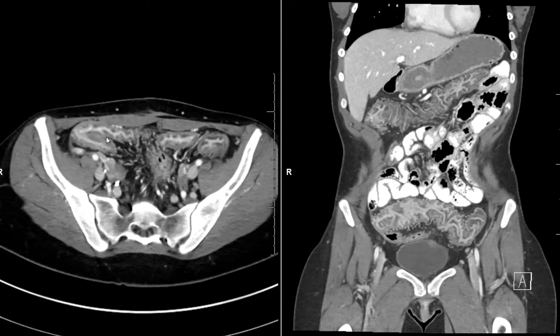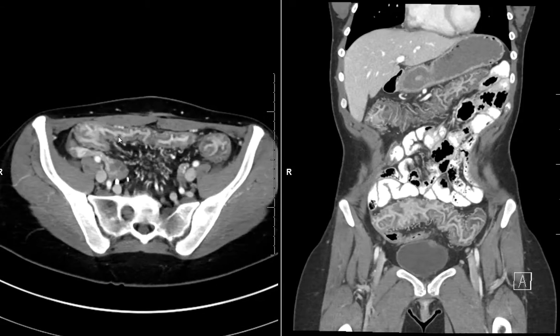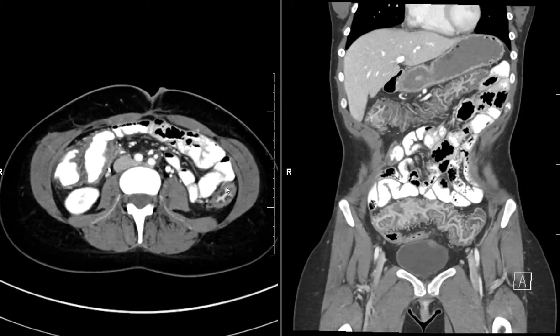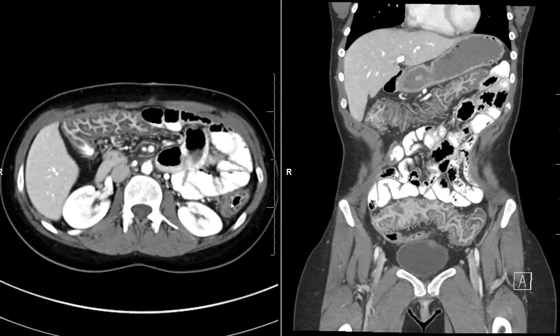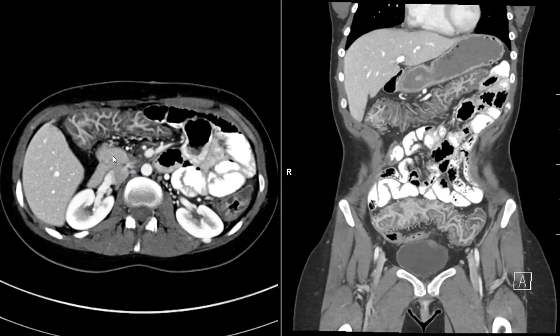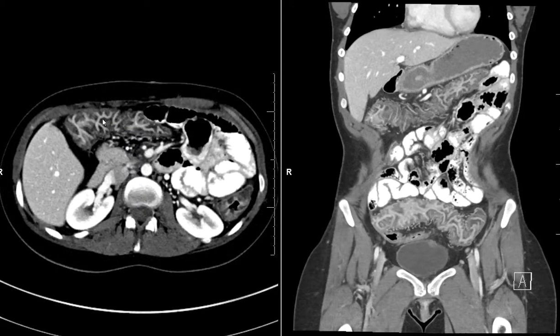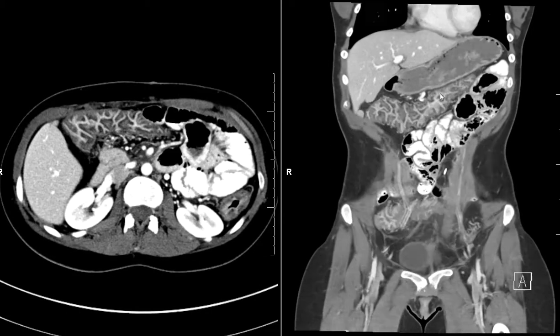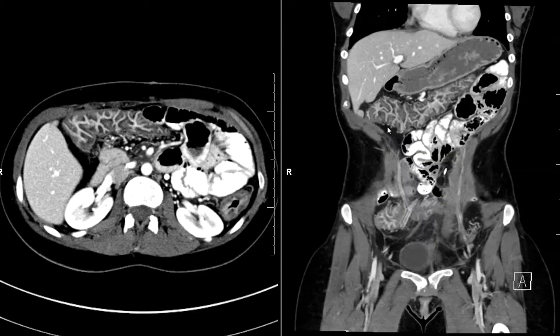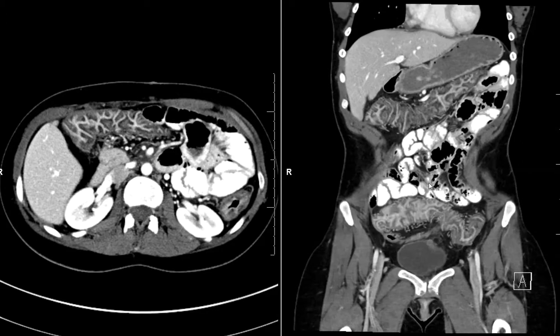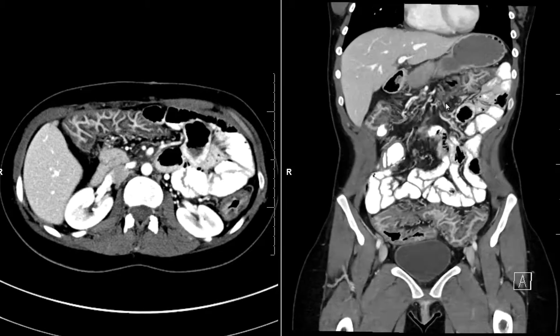The colon is non-distended to start with. There is diffuse mucosal enhancement, and also in the submucosal region what you also see is low attenuation, compatible with fatty infiltration, also called fatty halo sign. You can also see that on the coronal reconstructions here, with abnormality in the sigmoid and transverse colons.